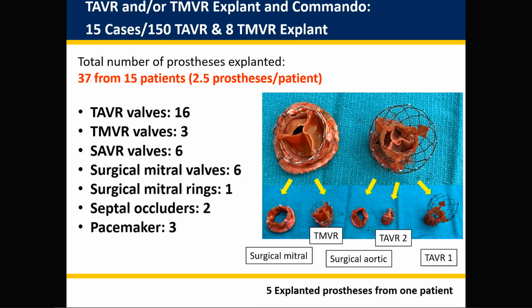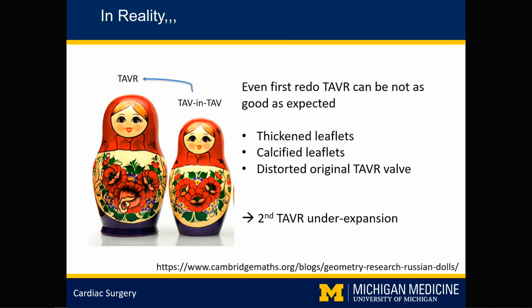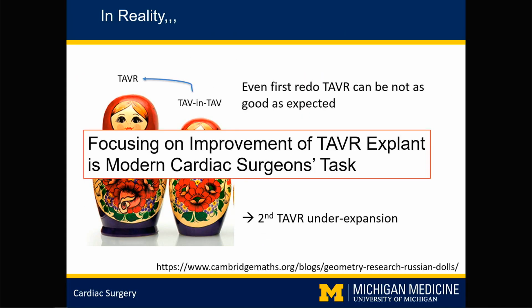37 hardware came out from these 15 patients. So we always talk about lifetime management, but how much hardware is enough? Every time we implant something, it gets progressively smaller. I think that every time we do something, it's not perfect. So we have to think about that.